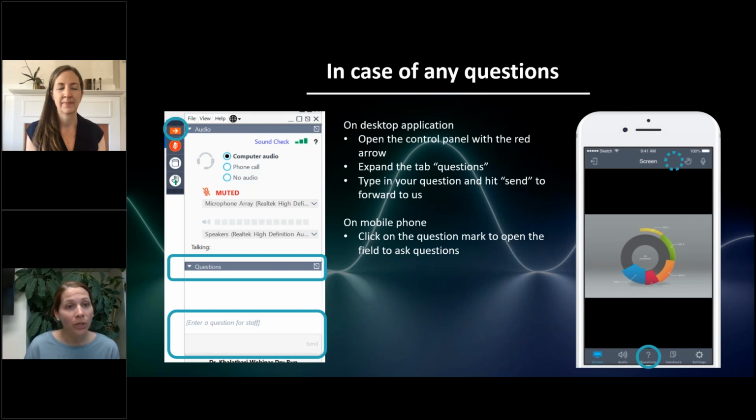So the first question is, which tests or tools available today would you recommend to a practitioner to understand optic nerve disease? So I think from a clinical perspective, we're still pretty similar to where we have been for quite a while. So one important piece is the function, which clinically we figure out by visual acuity and by peripheral vision testing, usually using visual field testing. And then in terms of the structure, the exam is very important, looking for pallor of the optic nerve or swelling. And then OCT for examining injury to the optic nerve, and an MRI scan for looking for structural changes behind the eye.